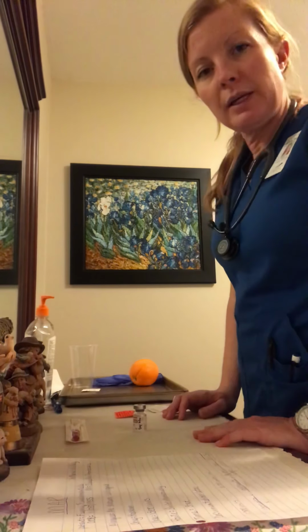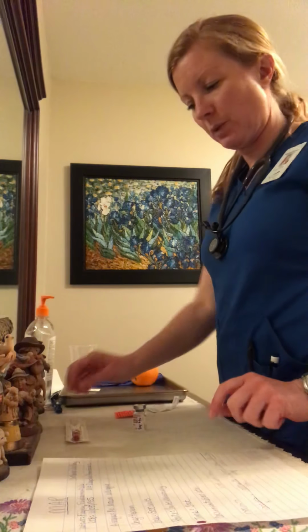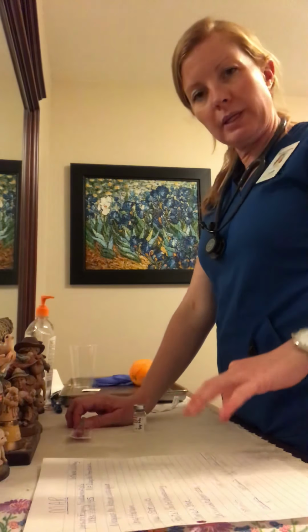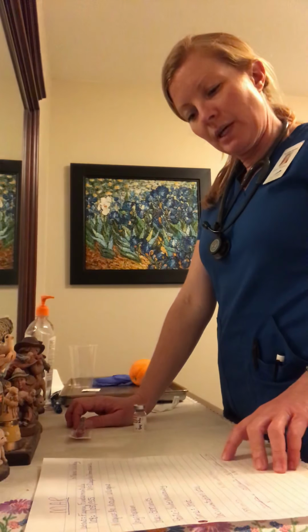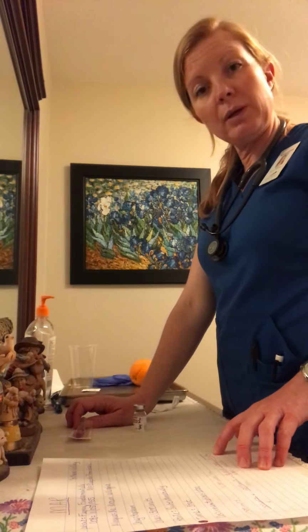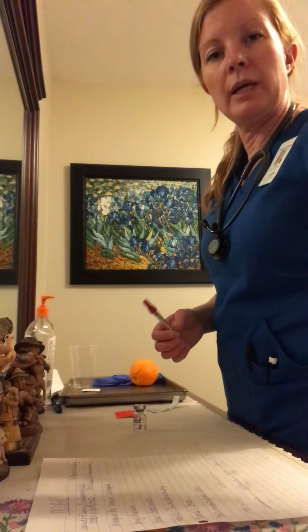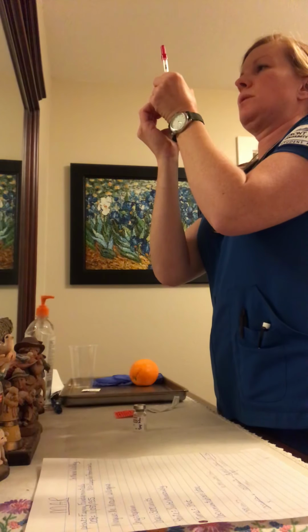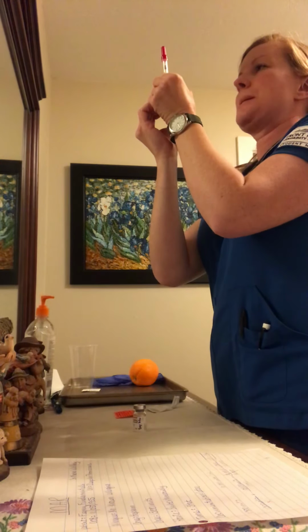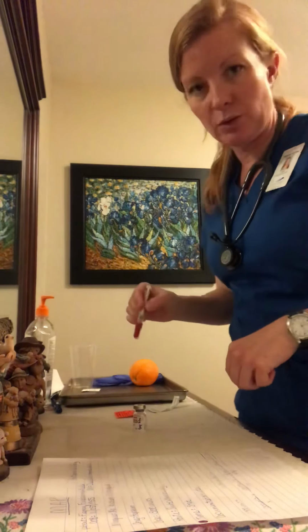So now, since heparin's dose is in 1,300 units and we're using a milliliter syringe, we need to calculate that. I calculated it, and 1,300 units is 0.13 milliliters. So I'm going to be opening our syringe, and we will be drawing 0.13 milliliters of air into the syringe to inject into our vial.